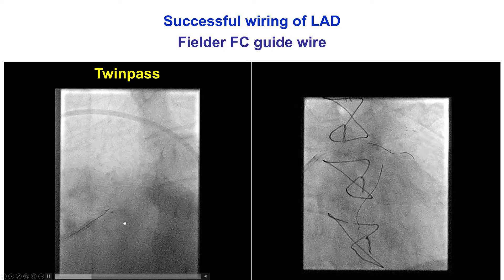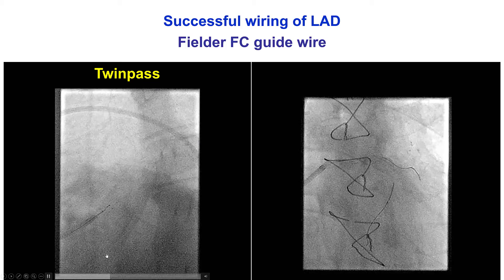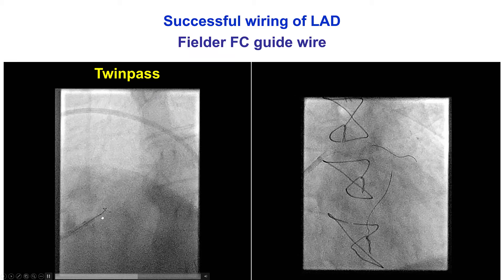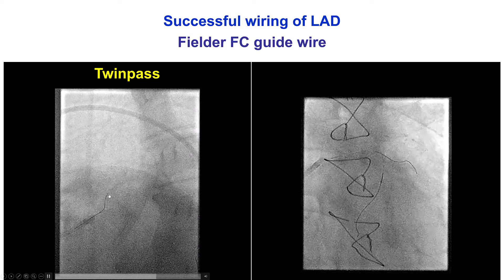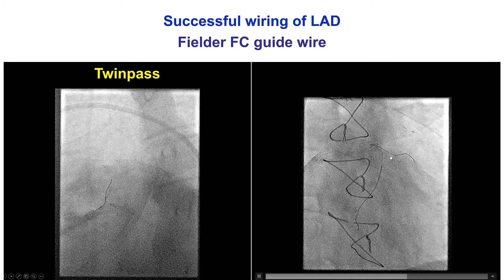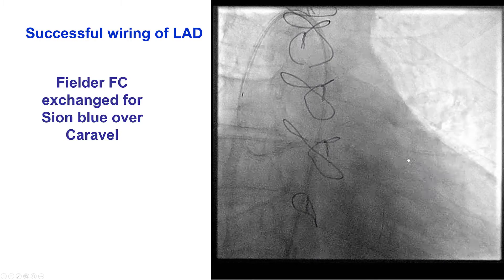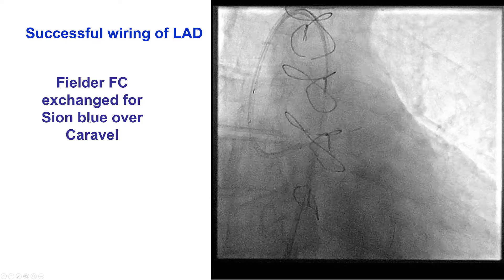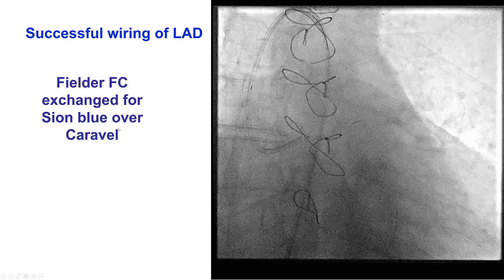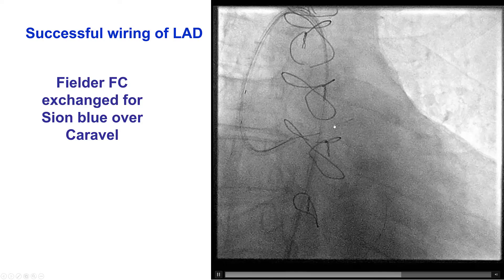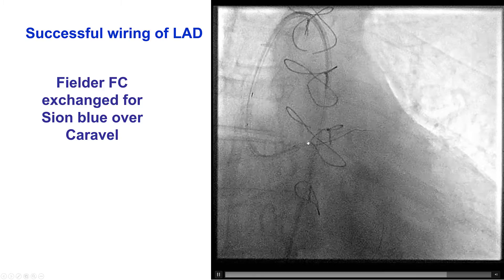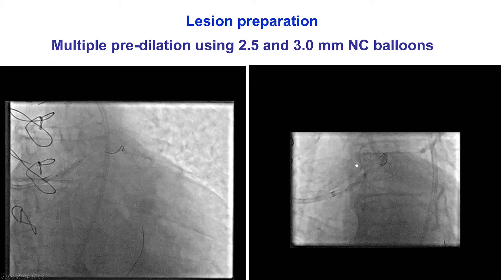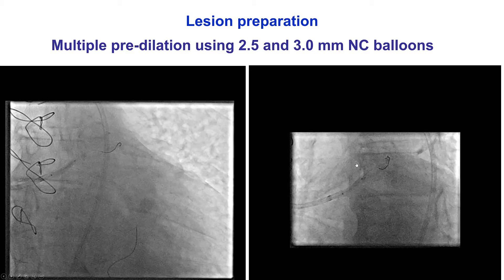Eventually, using the Fielder FC wire and the TwinPass, we were able to advance the Fielder FC guide wire into the LAD and then switch it for a soft workhorse Sion blue guide wire over the Caravel microcatheter. We finally had wiring of both the LAD as well as the circumflex, and were now able to start our intervention.